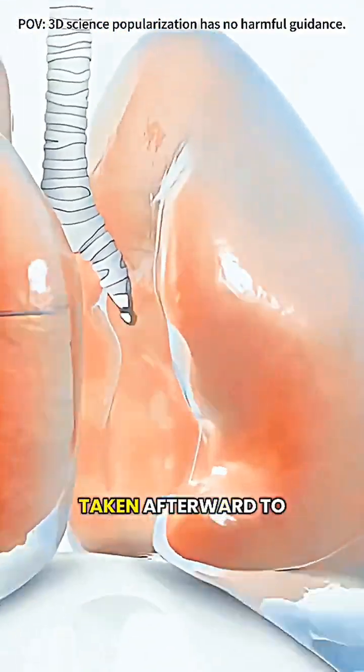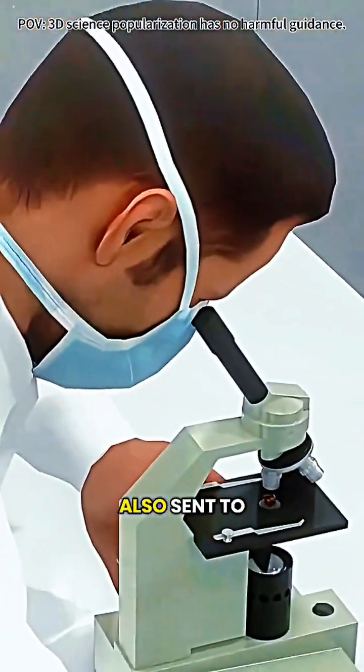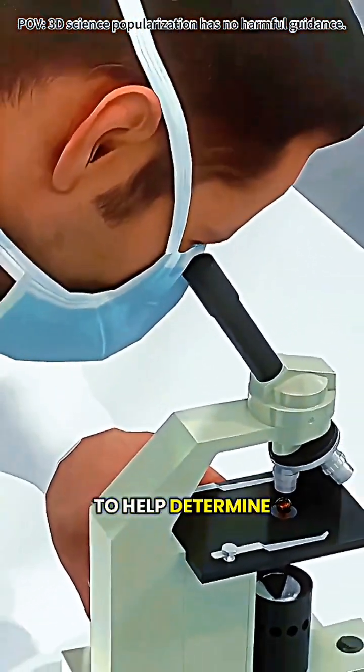A chest X-ray is usually taken afterward to check for complications like a pneumothorax. The fluid is also sent to a lab for analysis to help determine the cause.